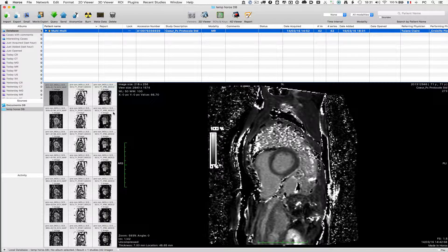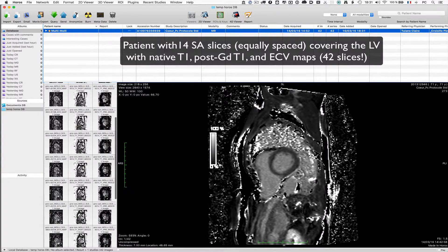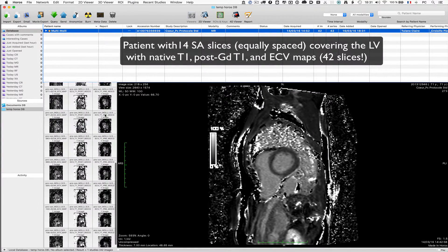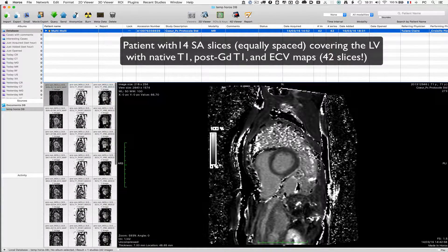In this example, I would like to show you how you can process mapping images with multiple slides and different contrasts. Here we have slides that cover the whole heart: 14 equally spaced images with native T1, post-gadolinium T1 and ECV maps.